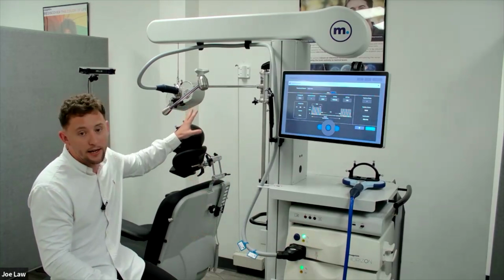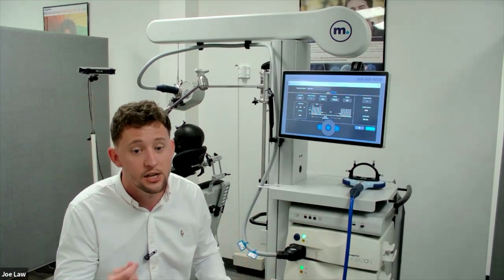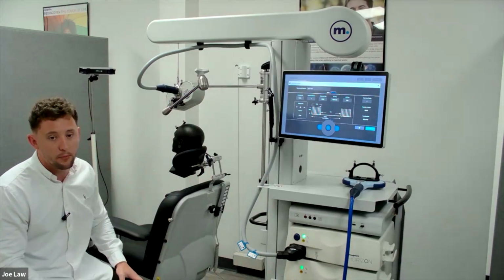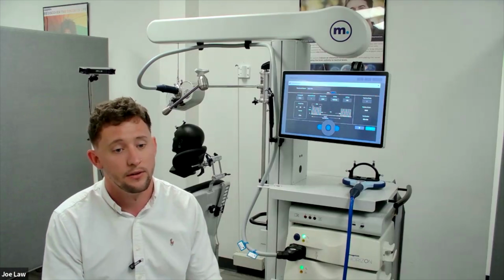The actual clicking of the coil, which is traditional and standard with all TMS devices, should always be louder than that fan. But again, if you've got a hot clinic and you're giving that coil a difficult time to cool down, then it's going to have to be loud. We make sure that that coil does not overheat and interrupt your patient's treatment, which is the number one priority here. So making sure that you have within our operating temperatures, you should be fine. The fan should not be loud.